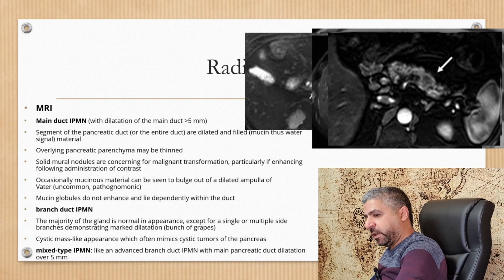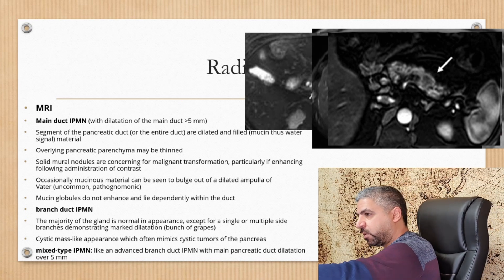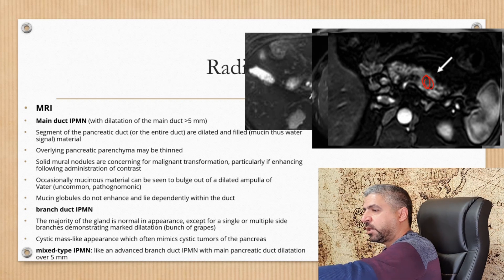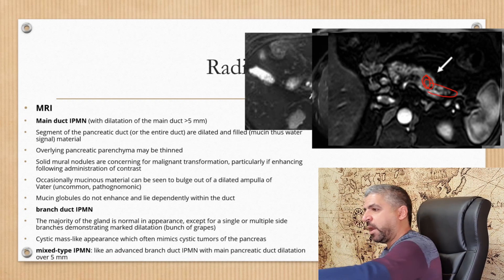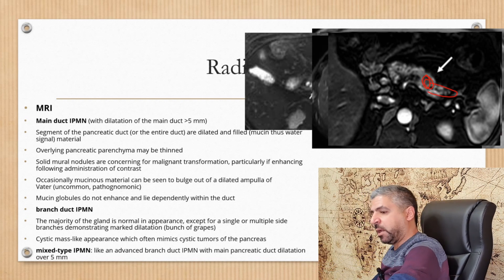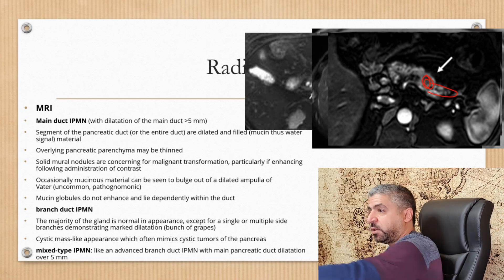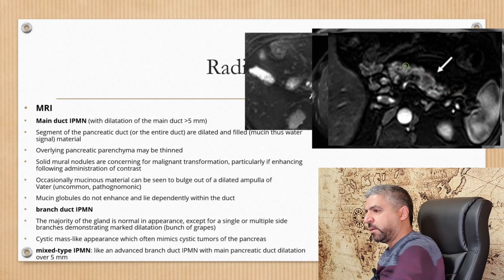On a T1 fat-saturated post-contrast image, you can see the cystic lesion with thinning of some areas of the pancreas — it is non-enhancing.